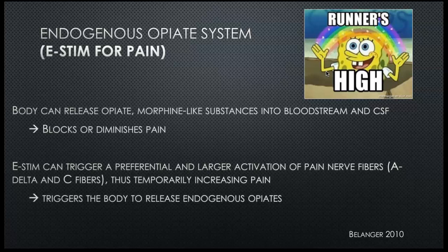There's something called acupuncture-like TENS, called that because it feels like somebody is poking you with a needle, same as acupuncture. When you poke a needle in there, it's a theory, we don't know, that this is why it makes people feel better, because it allows your body to naturally release those endogenous opiates.